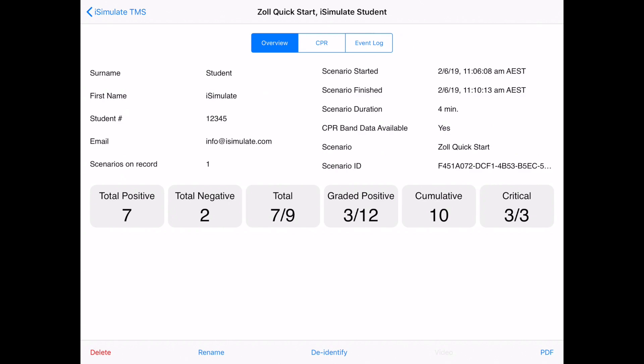So this shows us the student name, the student number, email, and the times that the scenario started, finished, the duration, and so on. I can also see a summary of all of the checklist items that are presented there.